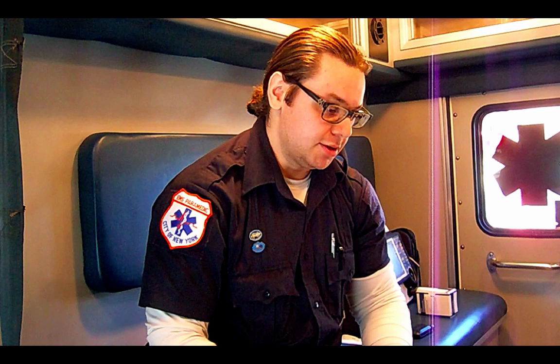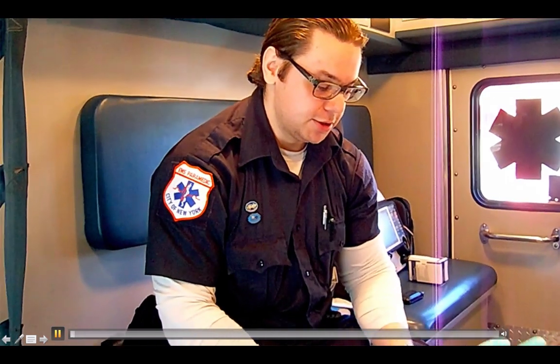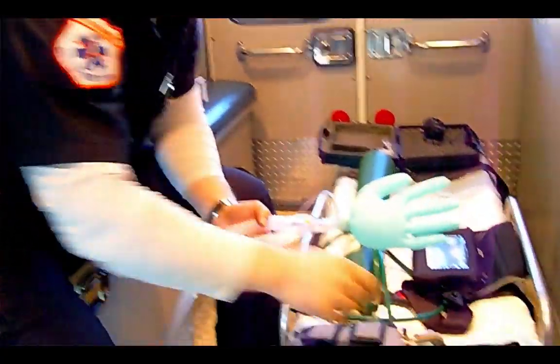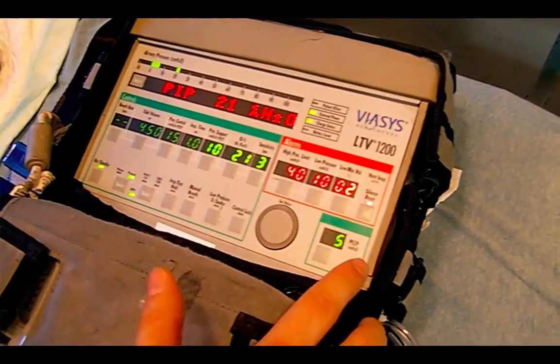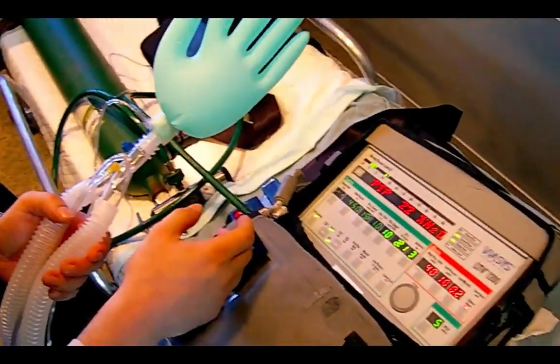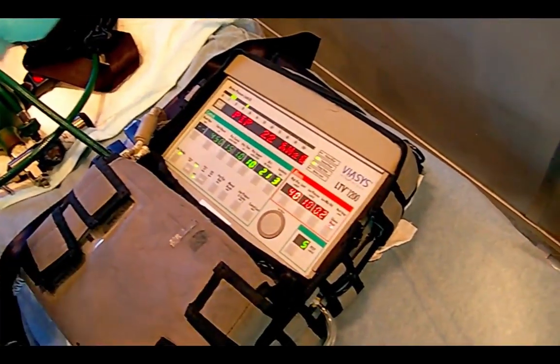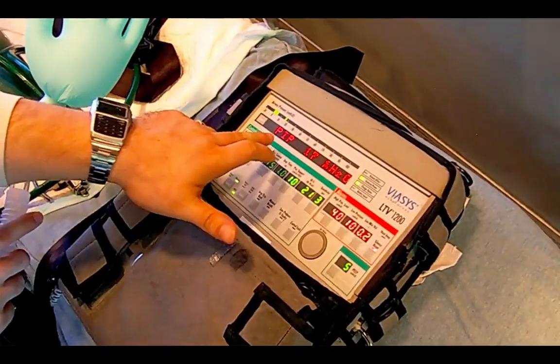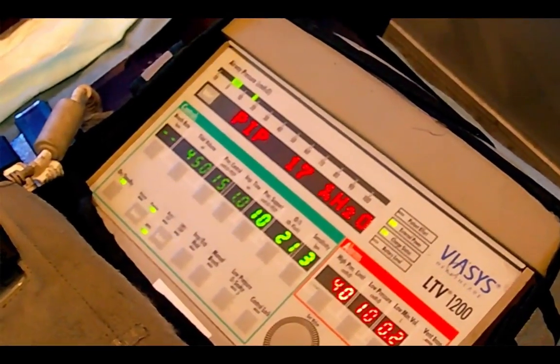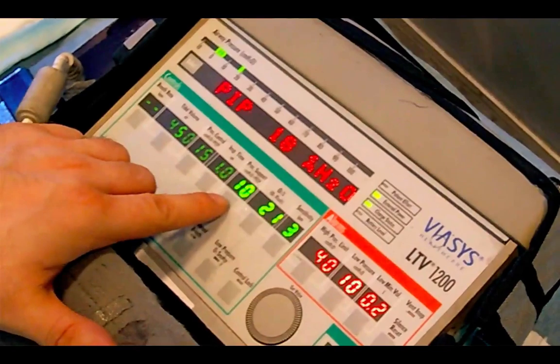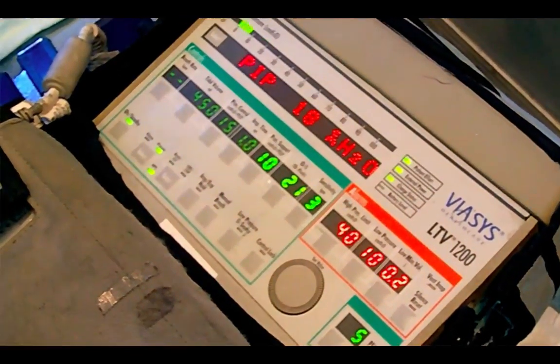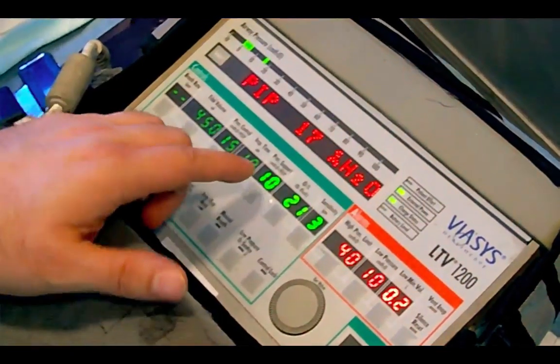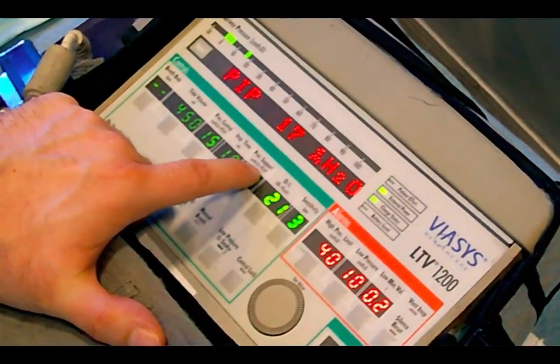Here's a video demonstrating what pressure support in addition to PEEP looks like on the LTV1200 interface. If you pay attention to the screen, we set this ventilator on non-invasive ventilation with pressure support of 10 and PEEP of 5. When the patient takes a breath, they're getting 10 of pressure support, and during exhalation they're getting 5. Look at the peak inspiratory pressure — you see it says 17. Because they're additive: pressure support plus PEEP combined gives you 15, and with any additional effort you'll see 17 or 18.